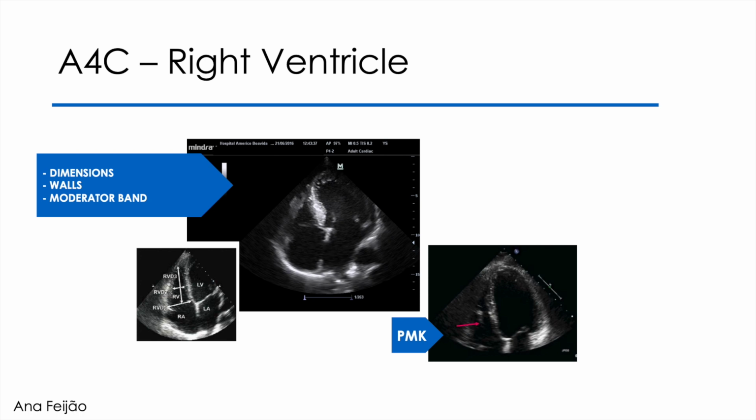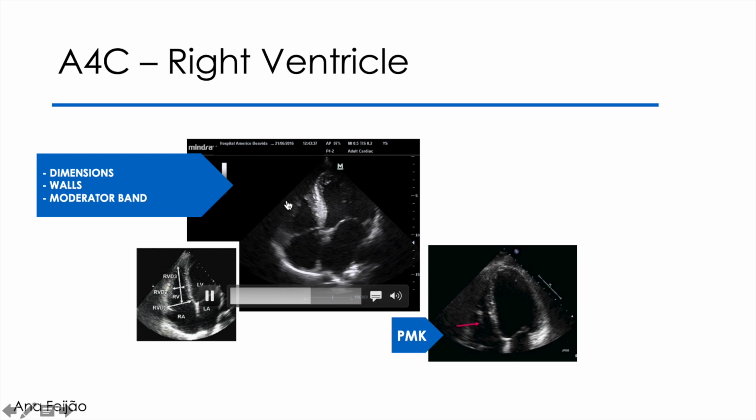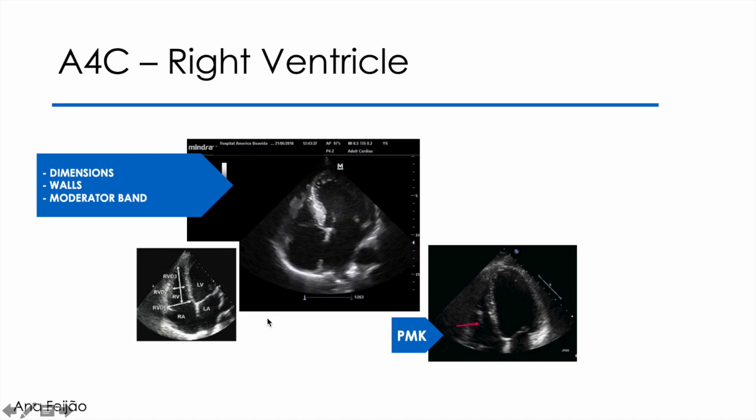Having assessed the left ventricle, I will assess the right ventricle in the fourth chamber view with the right ventricle centered. The right ventricle should appear in a triangular shape on the left side of the screen, in a normal heart, of course. The moderator band and the more apical annulus of the tricuspid valve identify this cavity. To study the right ventricle, we can center it on the screen so that it is more evident and we can see the free wall of the cavity well.